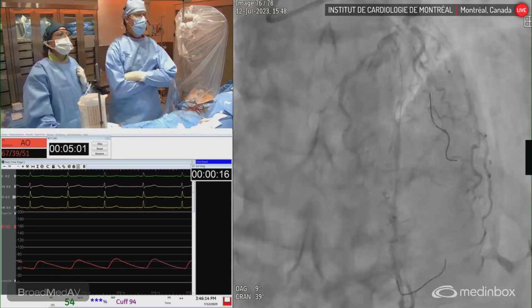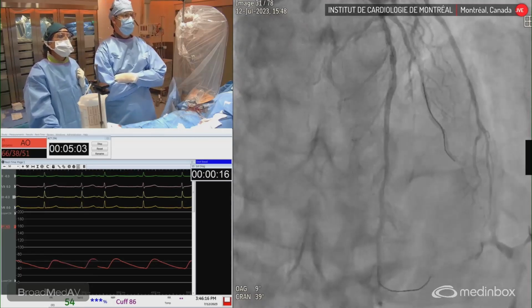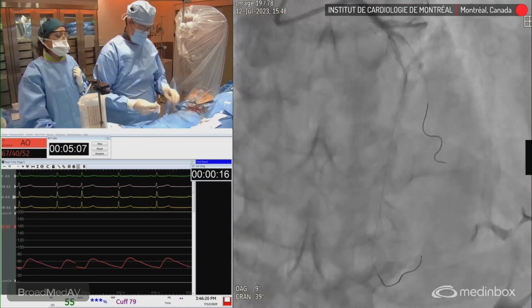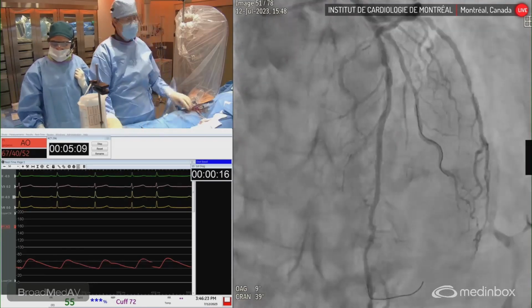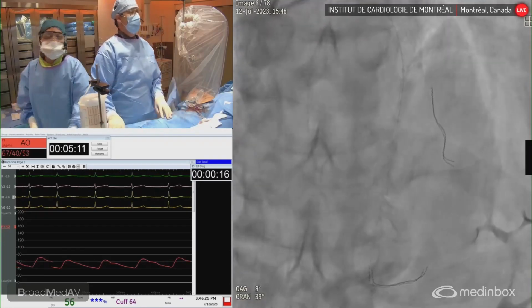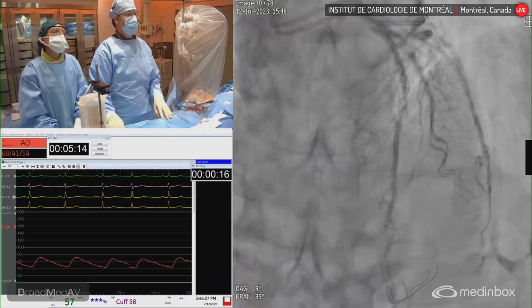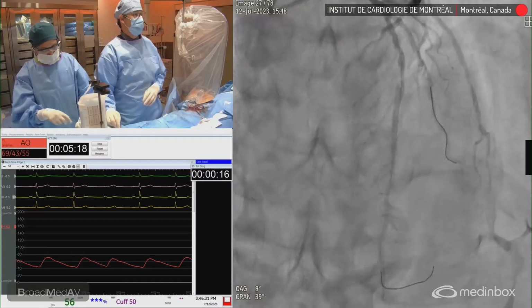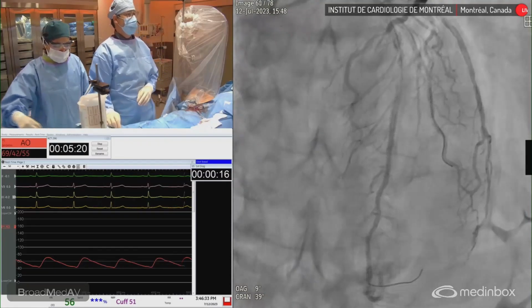We'll use a 2030 Onyx stent, a very nicely flexible stent. It performs really well. So we're going to see if it goes through the midsection of this diagonal branch, which we had difficulty with, but it certainly looks more open than it was before.